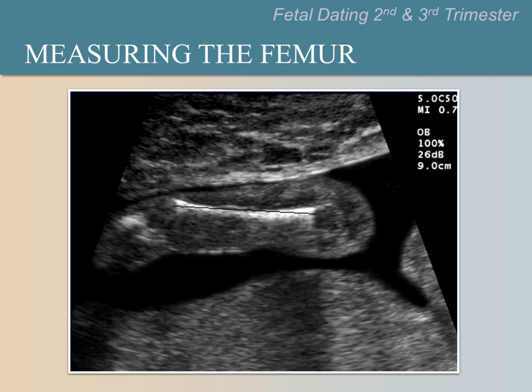Here's an example of a femur length measurement. Remember that bone is white. Measure the bone only. Do not include the black at the ends. That is cartilage, not bone.